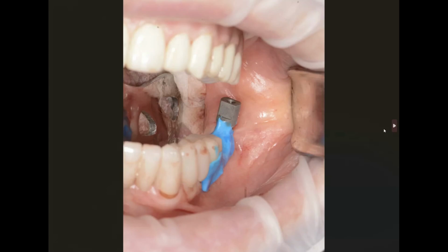There are limitations of the technology, which is one reason that I'm not a huge believer in intraoral photogrammetry with intraoral scanners, because they're all handicapped. Some are better than others. Some are definitely better than others. We can get into that debate, but not today. All right. But I like extraoral photogrammetry. Intraoral scanners are capable of what they're capable of, but they're very dependent on the scanner and the technique, who's scanning.